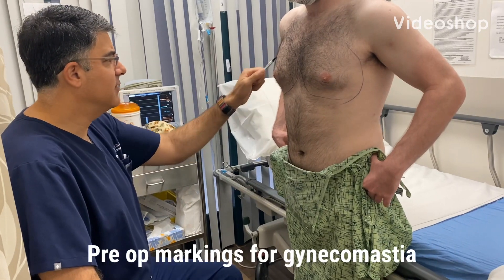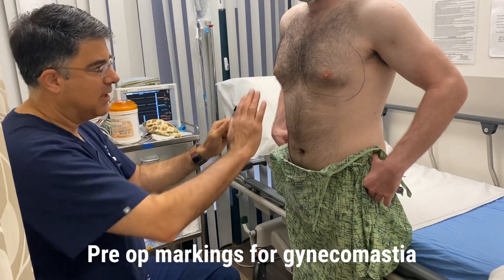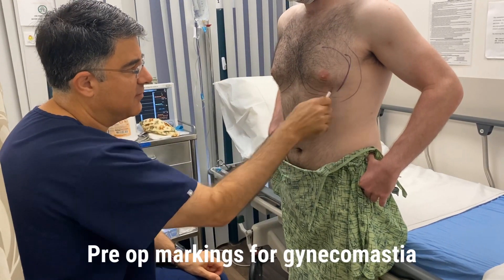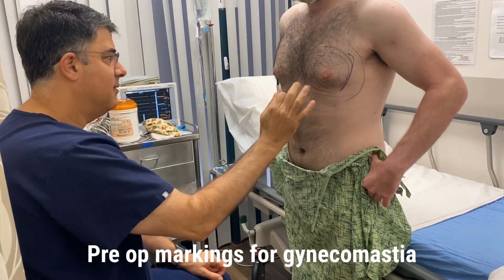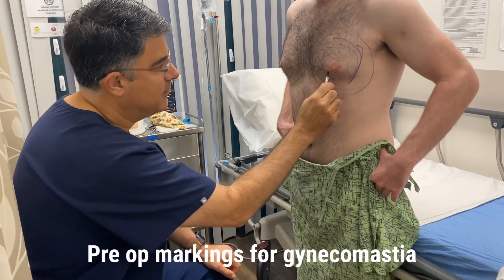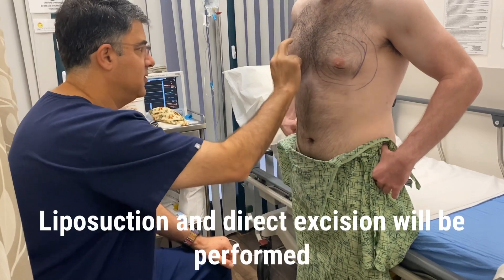This morning we're going to do excision of gynecomastia and I'll do liposuction. We put in tumescent fluid first and that numbs it all up. After it's numb we'll do liposuction with a power-assisted liposuction machine and then I'll make a small little incision right here. We'll actually remove some of this breast tissue.